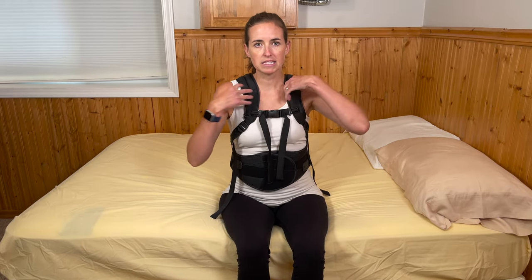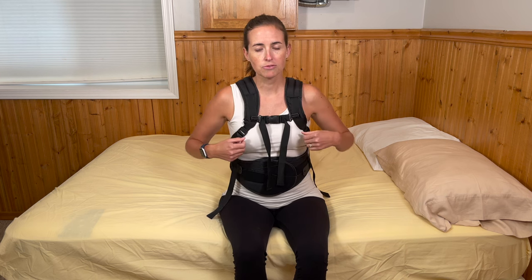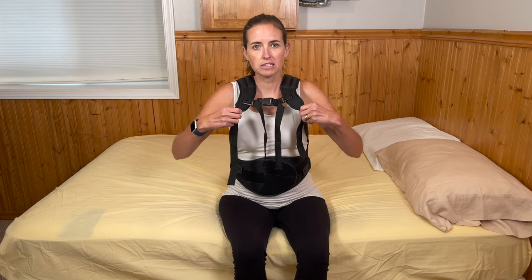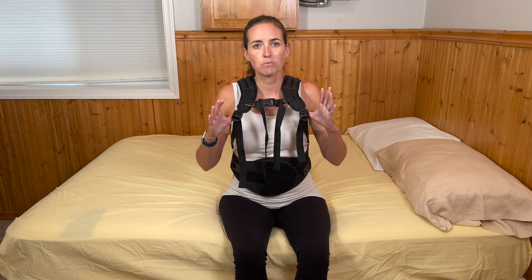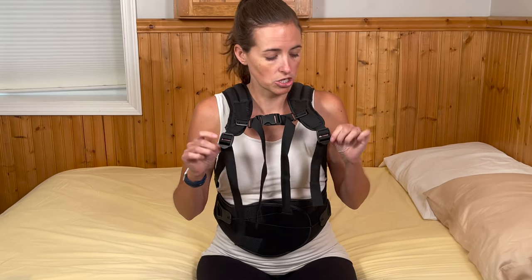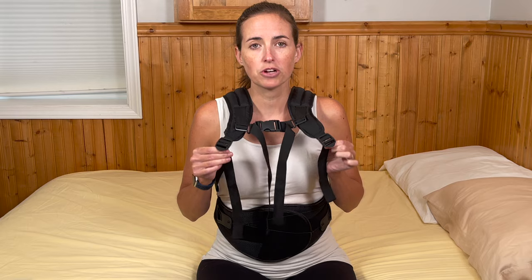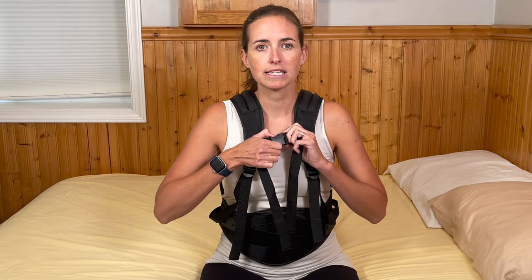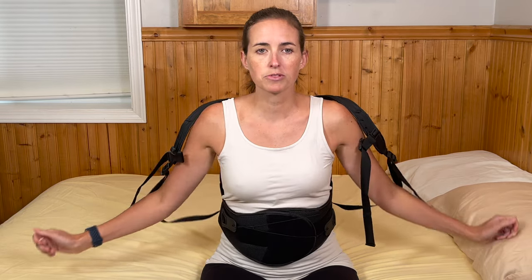Let's start the process of removing the brace. This brace has a thoracic component — if yours doesn't, you can ignore this initial step. I start by taking off these straps. First, locate the little clips on the side and loosen them. You want the upper part to be loose in order to remove it because it makes getting it back on again much easier. Loosen these two little belt straps and then unclasp the centerpiece — it removes just like a backpack, with each strap coming off easily when you've loosened them ahead of time.